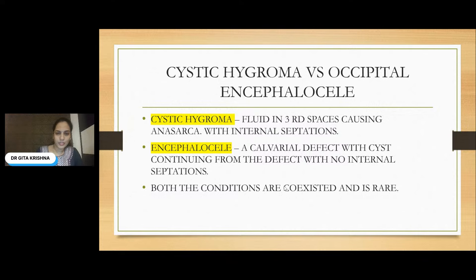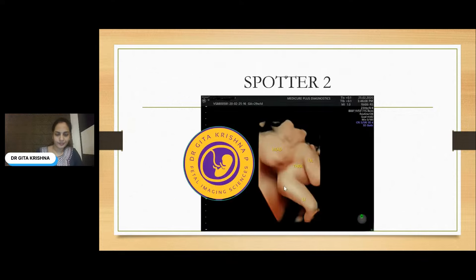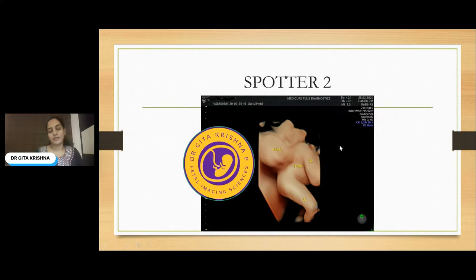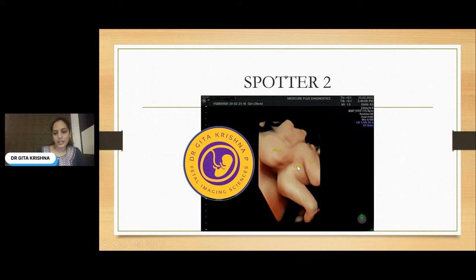We'll go to the next slide, spotter 2. This is the most interesting case that I've gone through in my entire career. This is the 3D image — the fetus is very cooperative with a good amount of amniotic fluid, so I was able to take good images. The head of the fetus is seen fused to the thorax. What is this condition called?